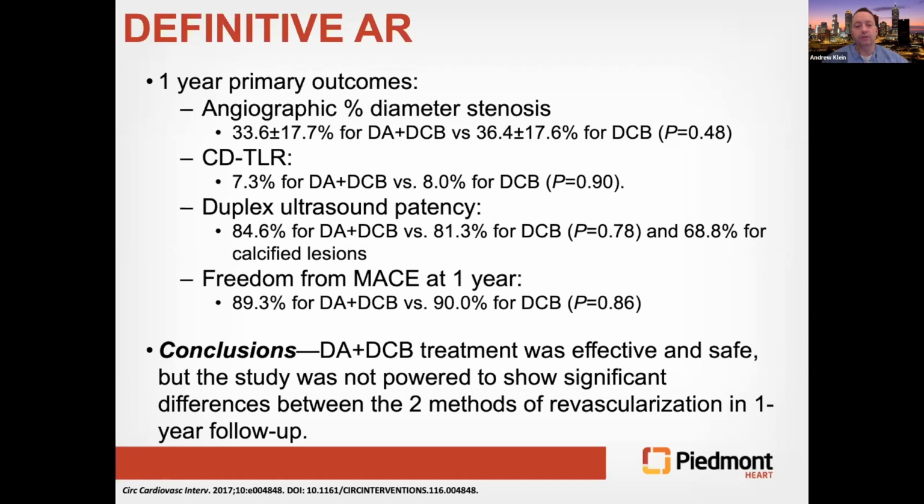These are relatively small. This was the first proof of concept in a larger study showing that maybe removal of calcium is going to make an impact on the efficacy of your DCB.